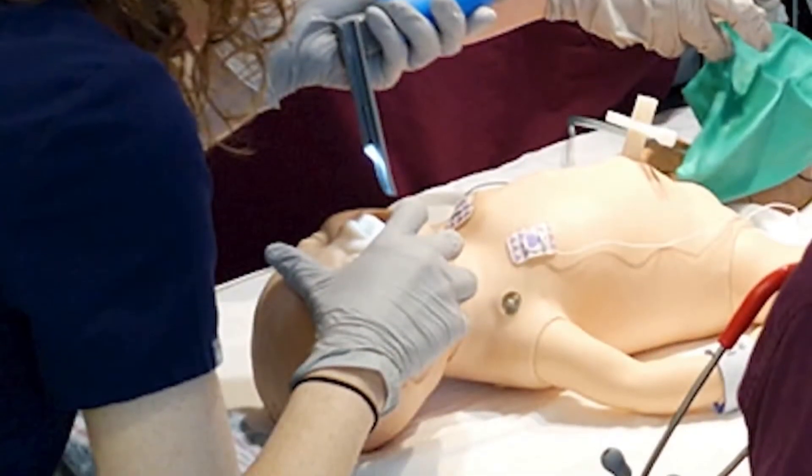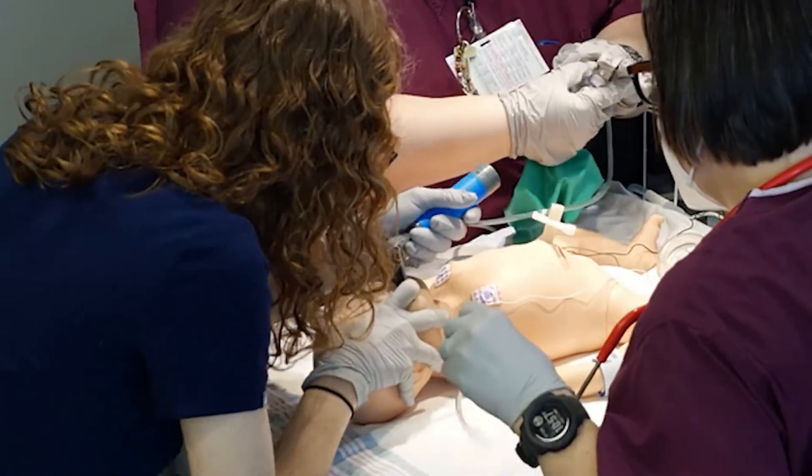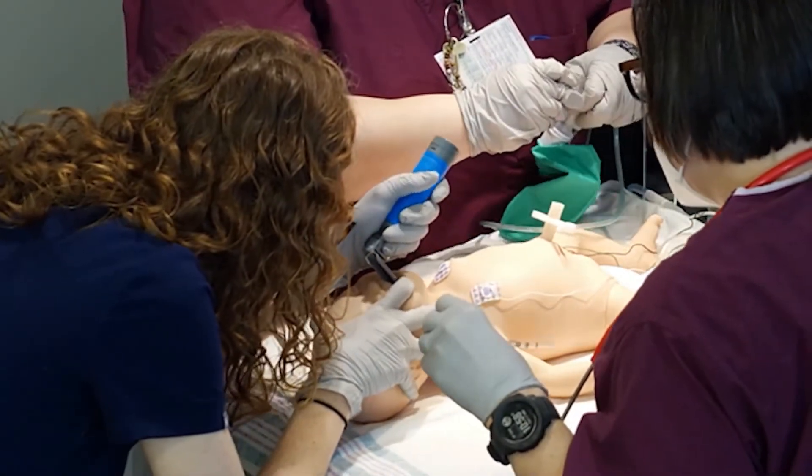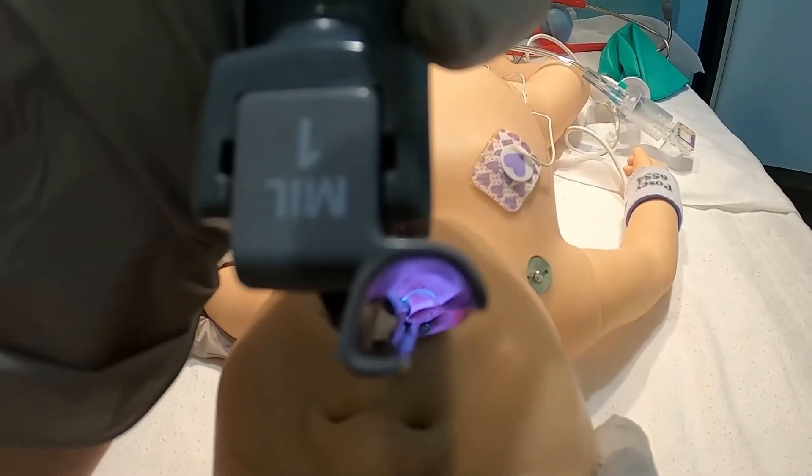Open the newborn's mouth with your thumb or right index finger. Insert the blade midline with the tip placed between the base of the tongue and epiglottis. Lift the laryngoscope away from the newborn's head — do not use a rocking motion. I can see the epiglottis, I see the vocal cords.